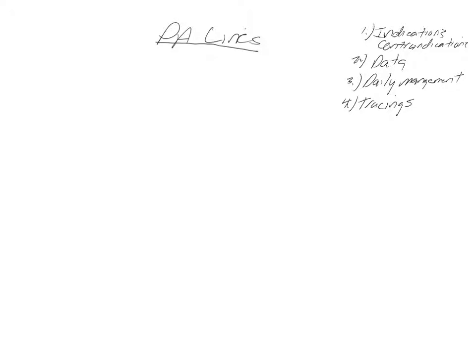And I'll start off by reviewing the indications, all of which are soft and not based in any well-developed evidence base, and then the contraindications. And I think about PA lines in 7 different clinical scenarios or diagnoses, most of which are relevant to the CCU.